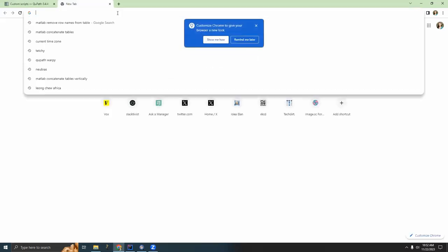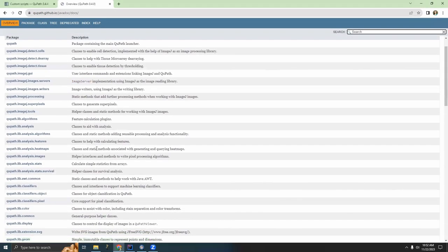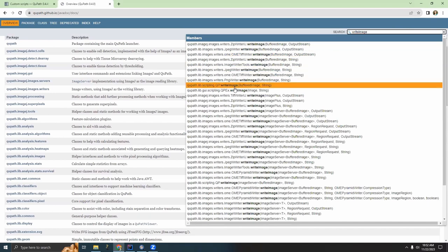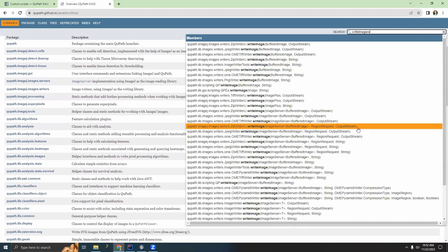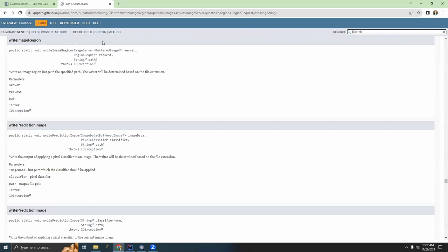Similarly, for more advanced users, the QuPath Java docs is very helpful. This is a good way of remembering syntax if you can't remember exactly which order the parameters are supposed to be in and things like that. So for instance, you can just search write image and it will give you all of the different types of write image commands that exist. And then you can click on it and it'll tell you it's expecting a server and then the region request and then the path. So if you've connected to IntelliJ, this will come up automatically. If you haven't, it's all in the Java docs.